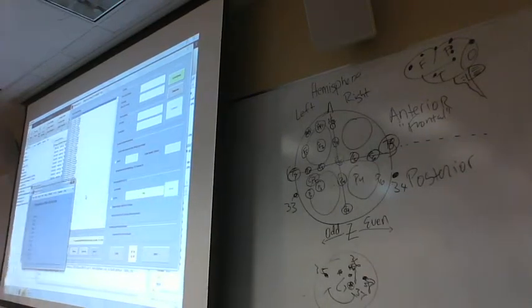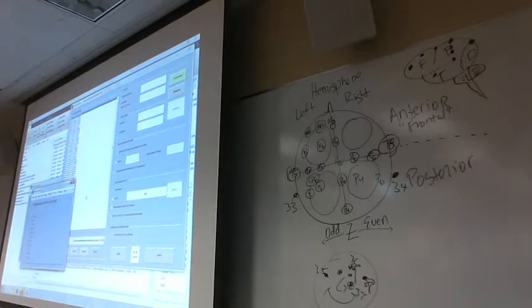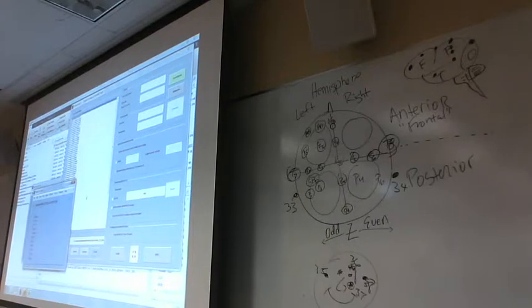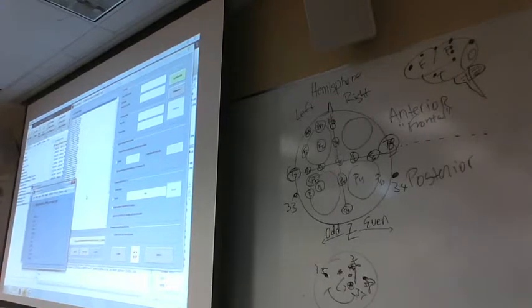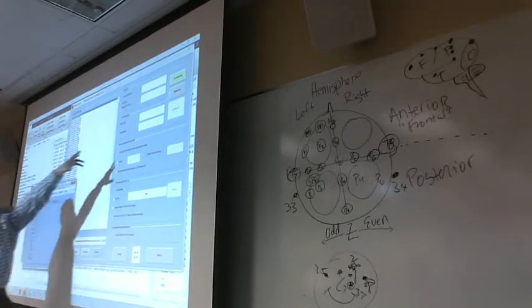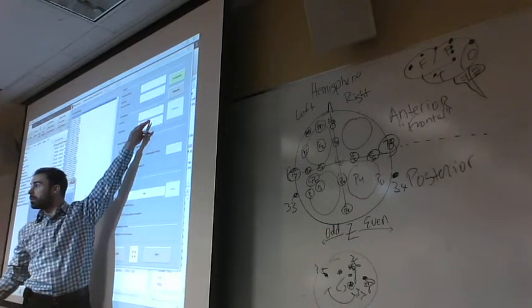Now we're going to have a bin for every single one of our 75 conditions, because they all mean something different. And of course we're going to create one of those bins and then we have to give it a name, so we have to give it a label too. For our bin number, we're just going to keep it simple: 1, 2, 3, 4, 5, 6, 7, all the way down. So for your bin number, just type one.